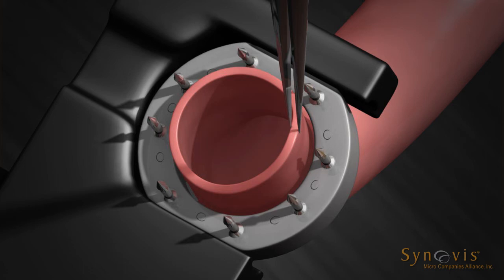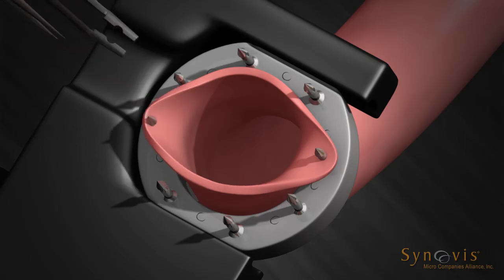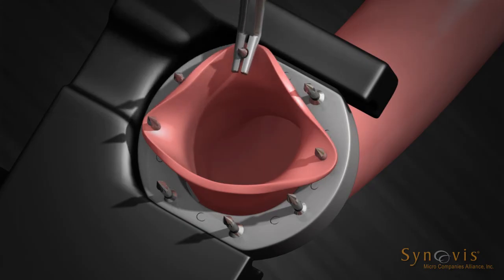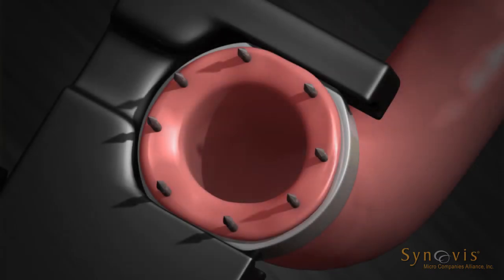Take a bite of approximately 1 to 2 pin diameters of the vessel wall and intimal lining. Evert 90 degrees and impale onto the pin situated closest to the open part of the jaw assembly. Impale the opposite side of the vessel opening on the pin directly across from the initial pin. Next, impale the vessel onto the pins located near the sides of the ring, keeping the vessel as evenly spaced as possible between the four pins. Continue vessel placement by impaling the vessel onto the two remaining pins near the open end of the jaw assembly. Complete the procedure by impaling the vessel onto the last two pins near the bottom of the jaw assembly.